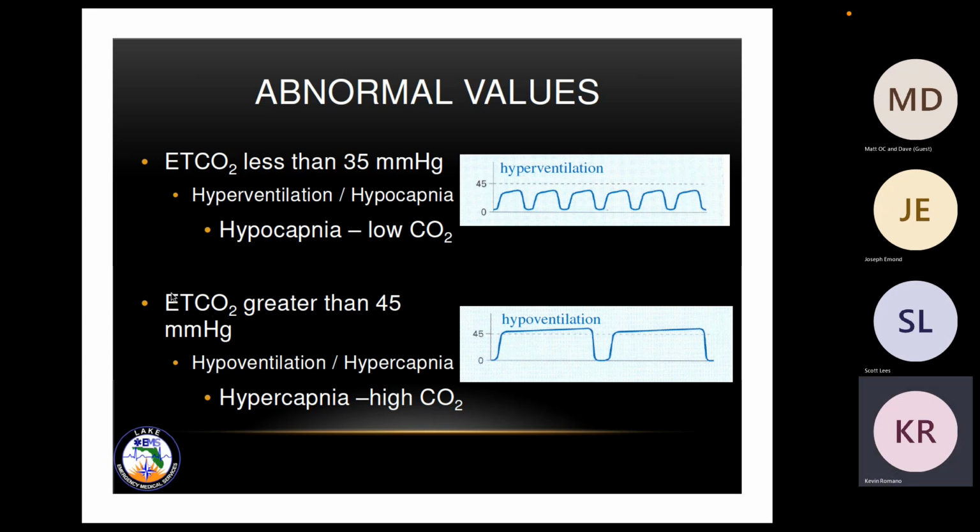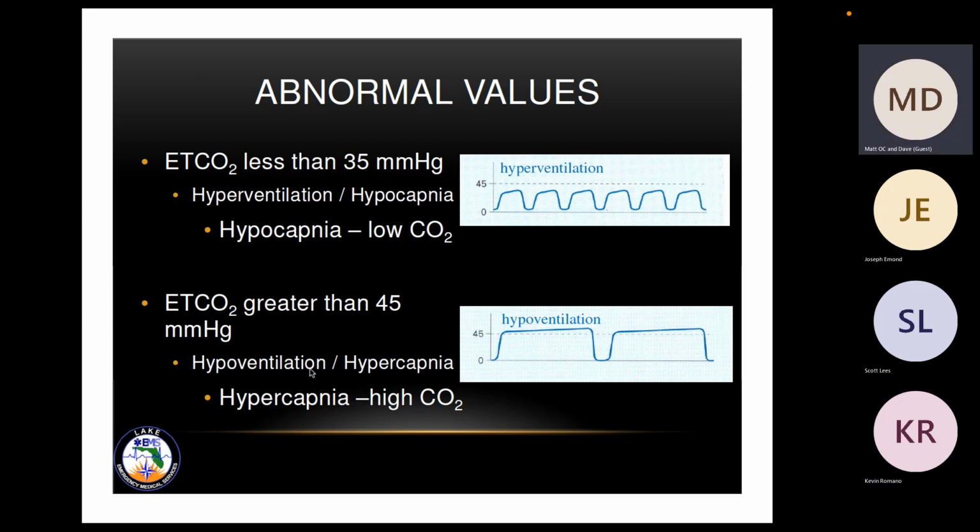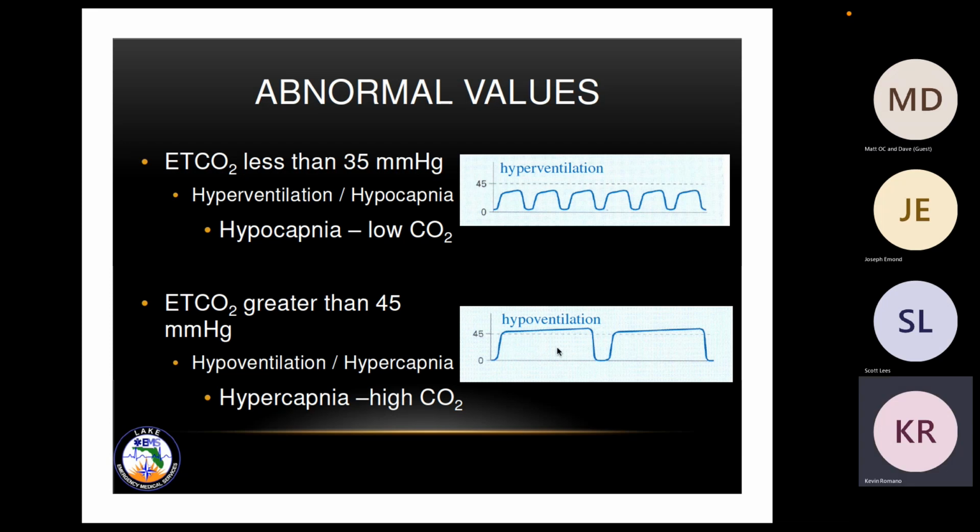So would this patient here be acidotic? Yes, but we get this long term here. Does the number change, so can we get someone who is hypoventilating with a shorter ventilation period, or does it always have to be long? So when they're hypoventilating, normally it's a longer phase because they're breathing so slow, versus your rapid hyperventilation, when you have your shorter period. Is that what you're looking for, Dave?